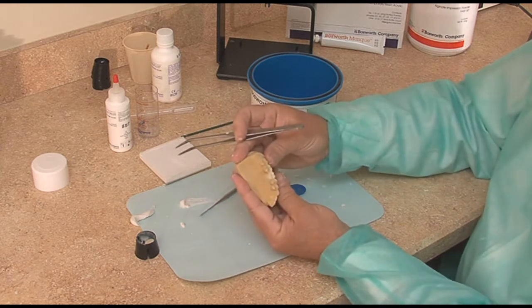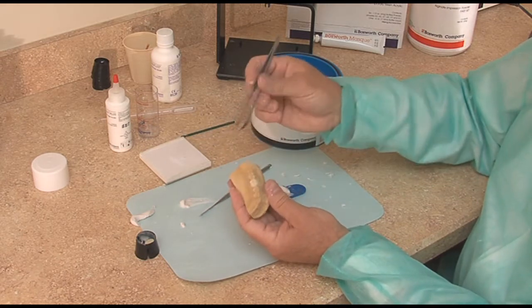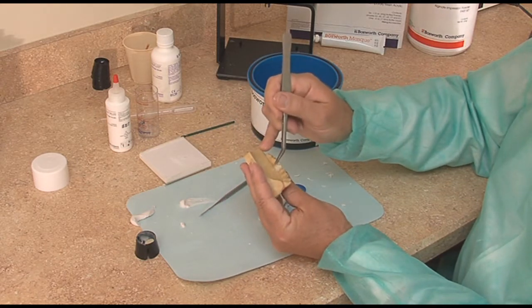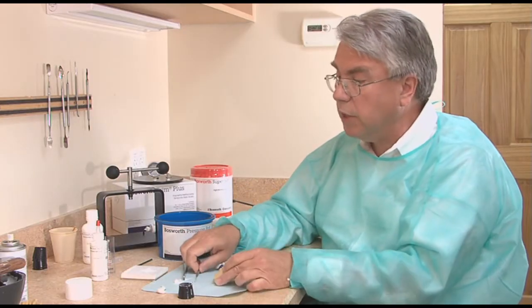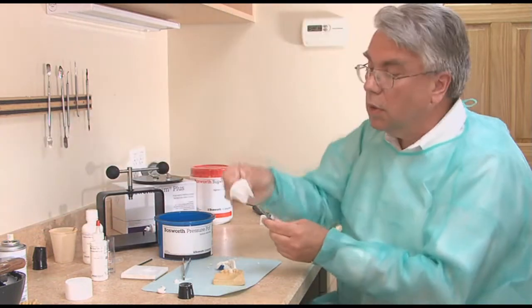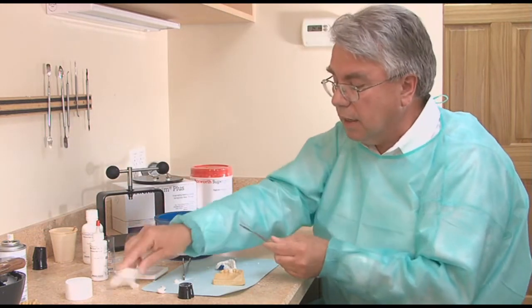Here's the temporary and it looks quite good. Now it's at a rubbery stage — you can see I'm indenting it — and what I have to watch out for is locking this in.